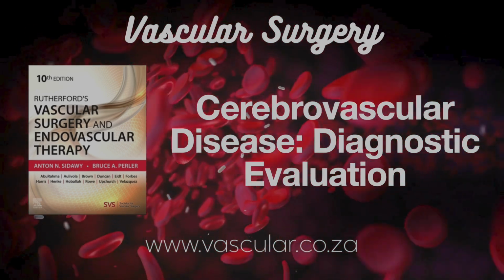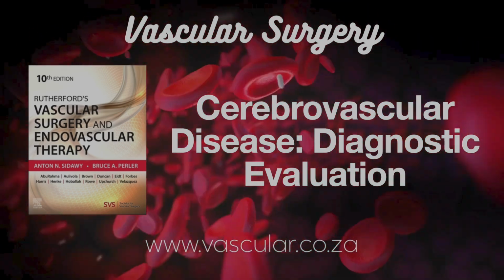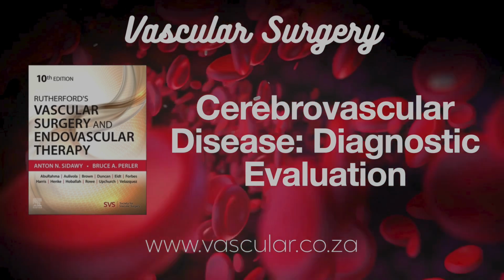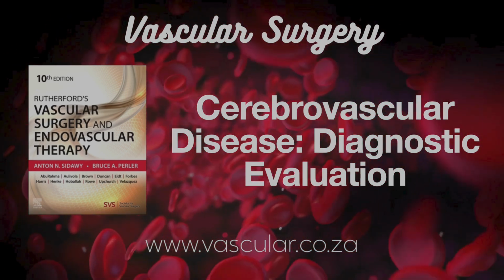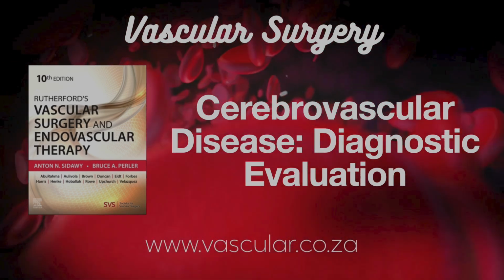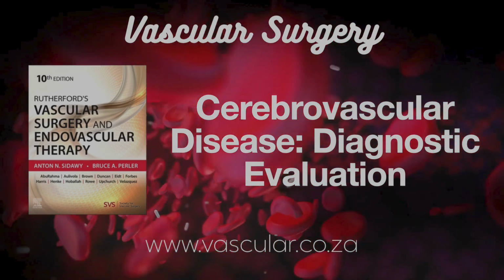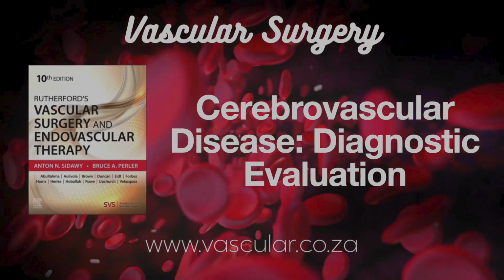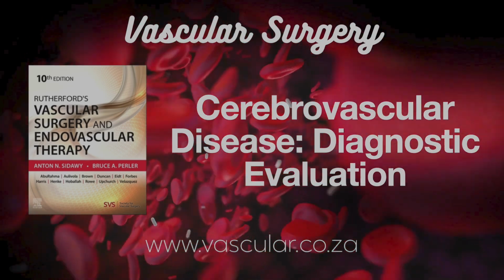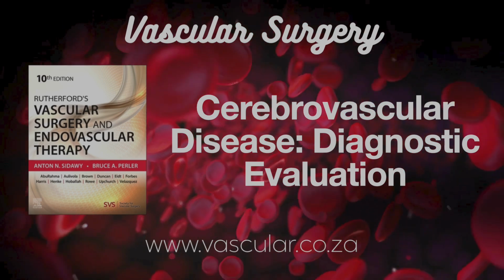Yeah. So DU sounds really valuable. Why is it usually the first test people get? Well, several reasons. First off, it's non-invasive. No needles, no cuts. Good start. It's also relatively low cost, and importantly, it's available pretty much everywhere. Most hospitals, vascular labs, they have it. Okay. And the big thing, it's actually very accurate for picking up significant stenosis. So accurate, in fact, that nowadays most carotid endarterectomies, that's the surgery to clean out the plaque. Right. CEA. Yeah. Most are done based just on the duplex ultrasound findings. That tells you how reliable it is in many cases.